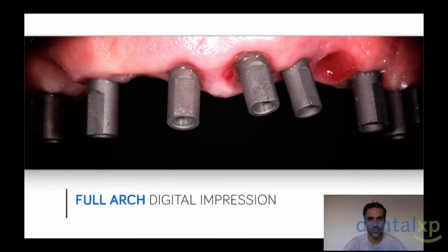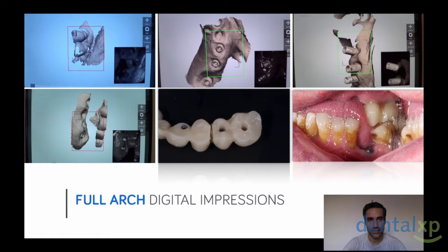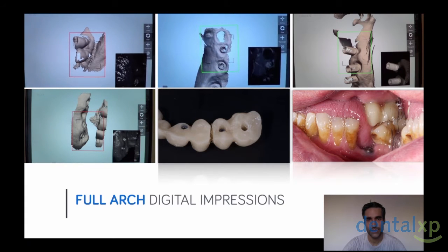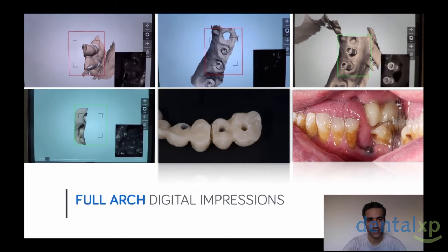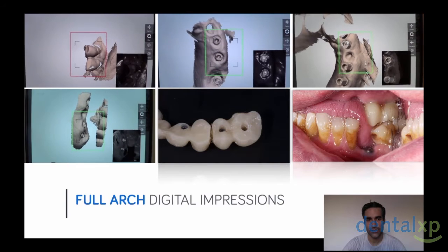Now we are going to perform a digital impression of a full arch. So this is the new thing, how we do it. The first thing we take, you see the video in the left top. You see that we are scanning the antagonist, then we scan the emergence profiles, then we scan the scan bodies, then we have to scan the intermaxillary relation, the vertical dimension.